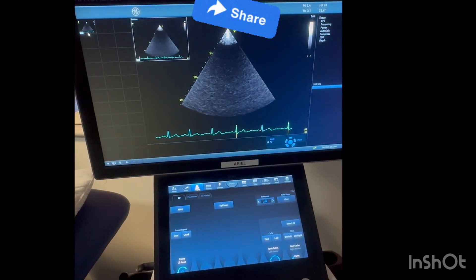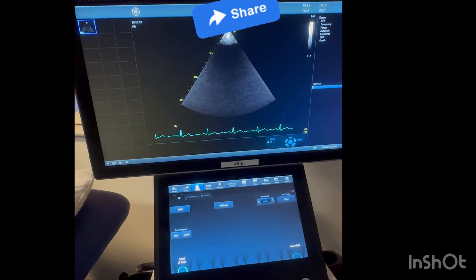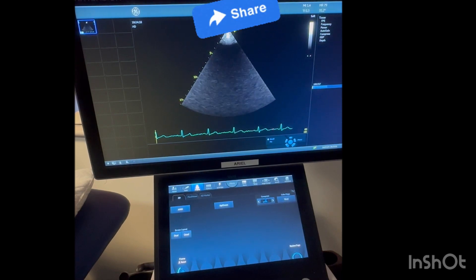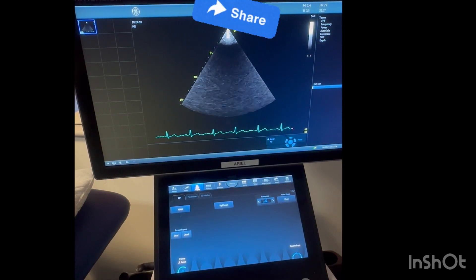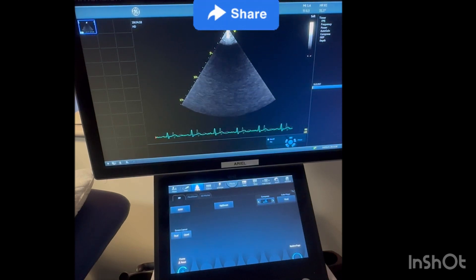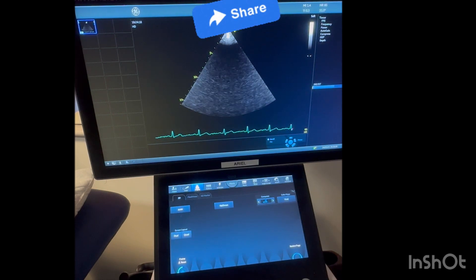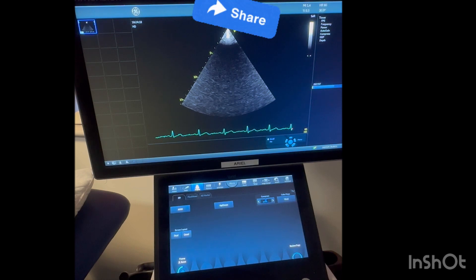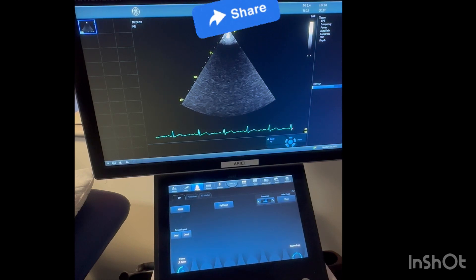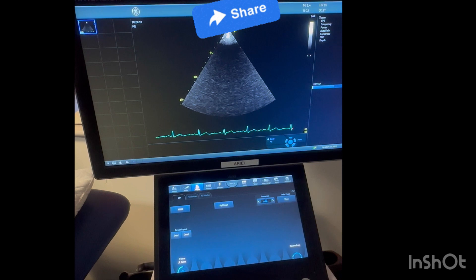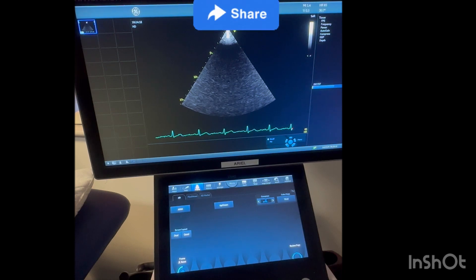Now I'll show you the image we acquired. Press the button and here is the acquired image — pressing slow playback, it starts from the beginning. You can see about 10 to 12 beats were acquired. Going slowly through them, you can check beat by beat: first beat, second beat, when bubbles start coming in, whether there are bubbles on the left side or not. You can count the beats and diagnose whether it's intracardiac or extracardiac. I hope you understand how to do a bubble study and acquire the images. If you have any questions, feel free to ask and I will make another video. Thank you, bye bye.